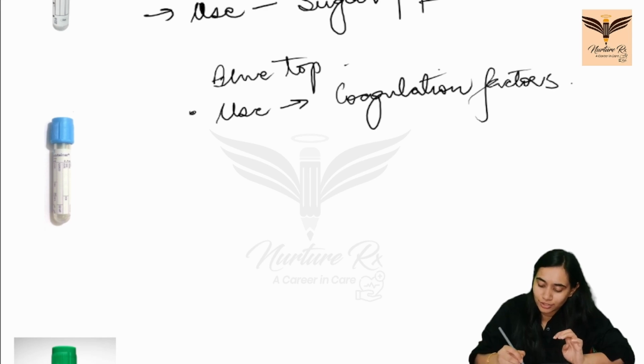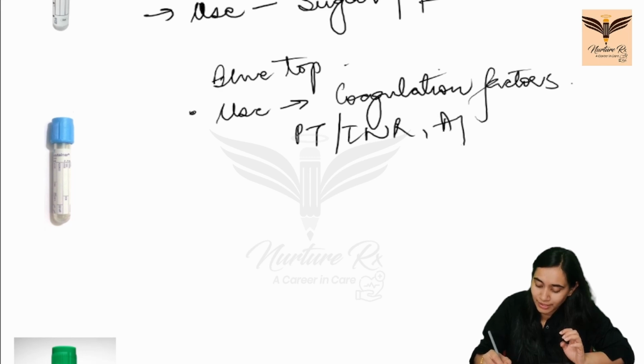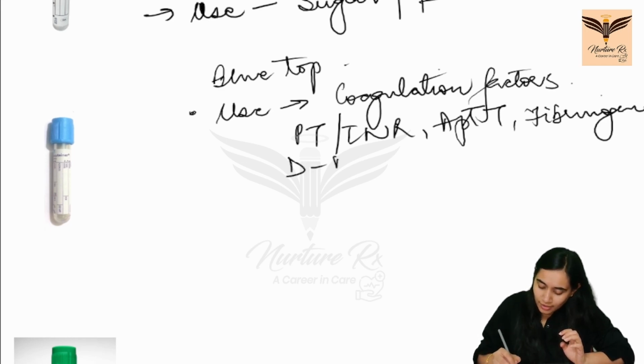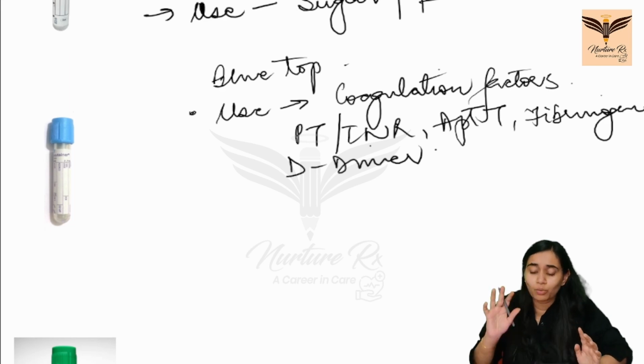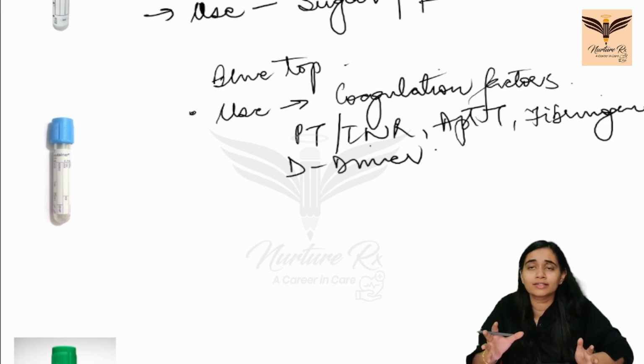So what are the coagulation studies? PT, INR, APTT, fibrinogen, D-dimer. You name it, you have it.